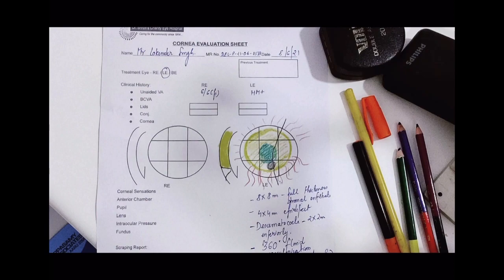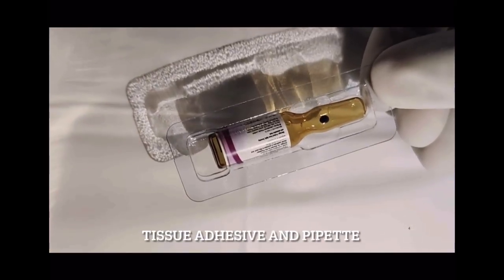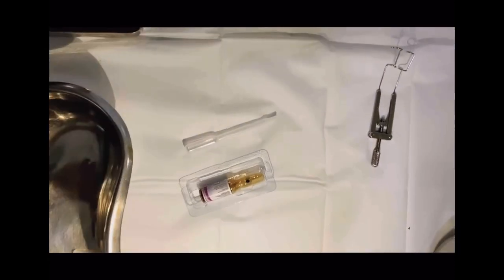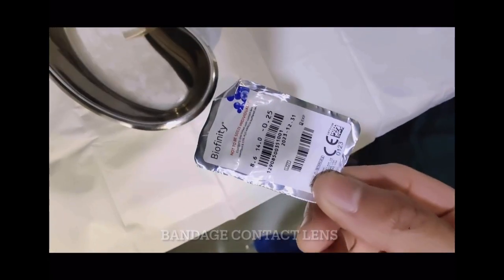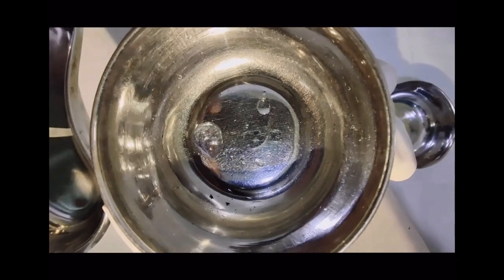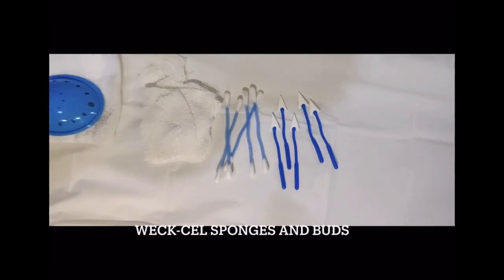So once we have decided to take the patient for TABCL procedure, it's important to know the material needed. So here is the vial of TA with pipette. Bandage contact lens is taken. A 15 number blade mounted on a Bard-Parker handle. A few Weck-Cel sponges and buds.